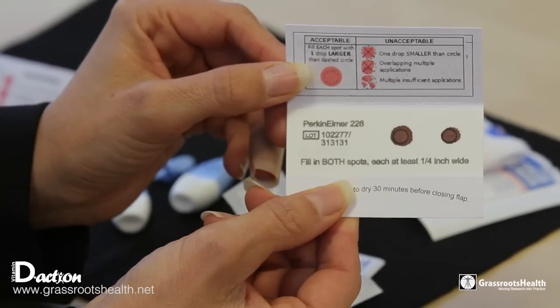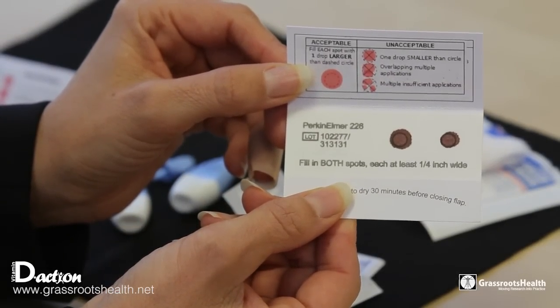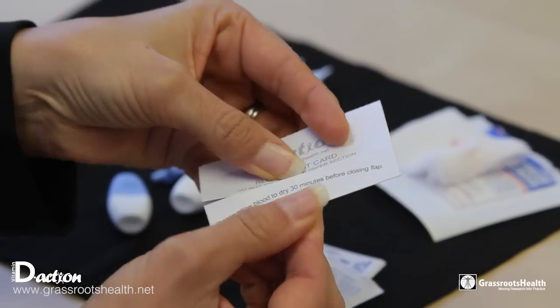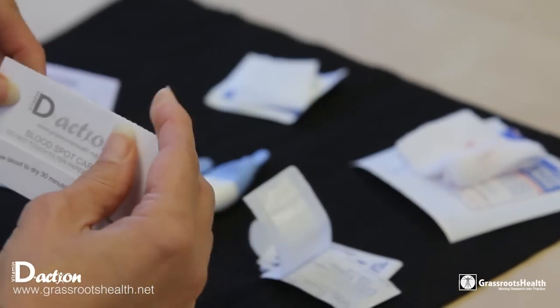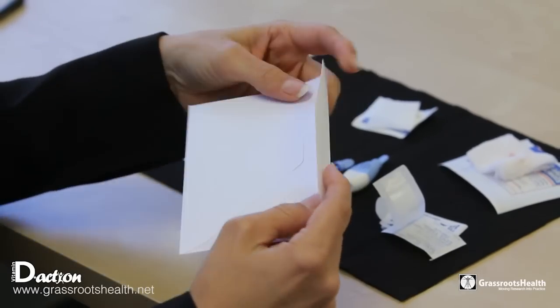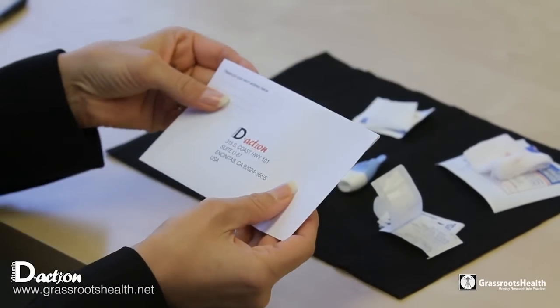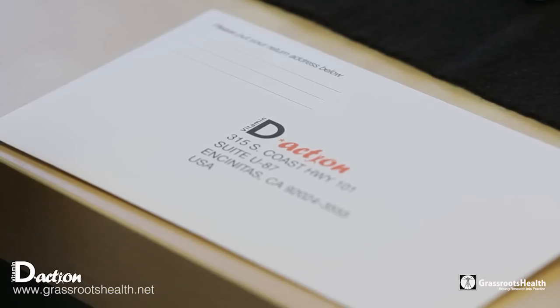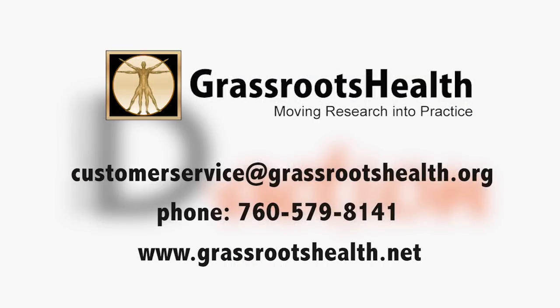Once you have dried your blood spot card, it should be slightly brown and look like this. Close the top flap and tuck it in ever so slightly, put it in the envelope, make sure your return address and stamp are on it, and send it off. You will get your results within the next seven to ten days. Thanks so much for participating — if you need customer service, you can visit grassrootshealth.org or contact us via the customer service hotline.